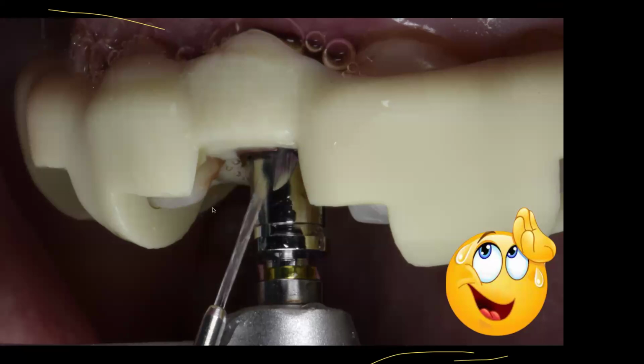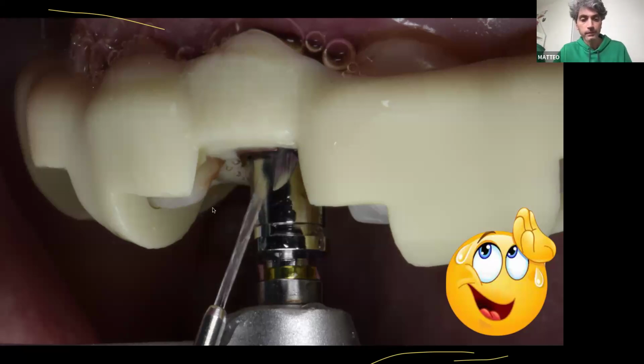So, in conclusion, normally you have always to start drilling crown down. Okay, crown down. First, the interference, the coronal interference, then the middle part of the bed, and then the apical part of the implant bed. In this way, this system works fantastically.